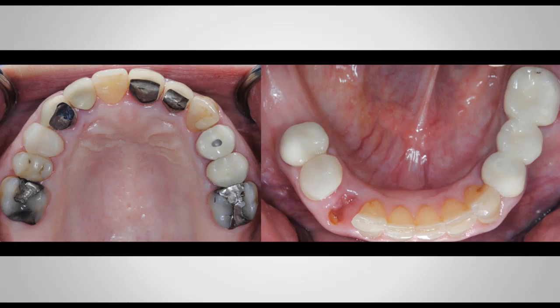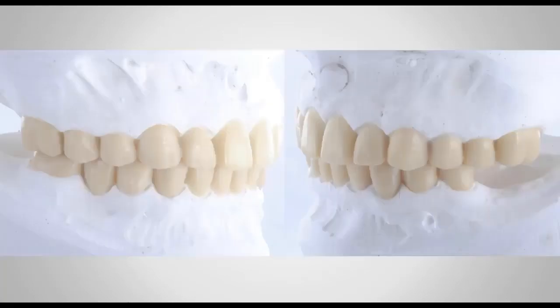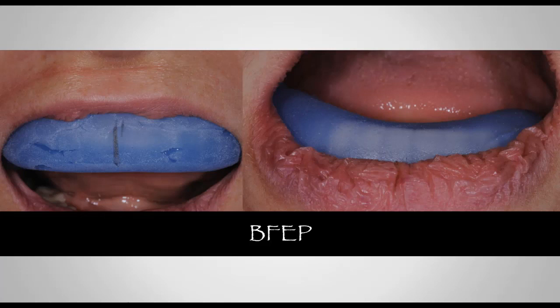And this is an occlusal view of how we were getting started on this case. And this is my wax up. So I mounted the cast and sent it to the lab. I altered the vertical dimension 3 millimeters, and I fabricated an incisal guide so that the lab knew exactly what I was looking for. They waxed the whole case up for me, and then I fabricate these already.